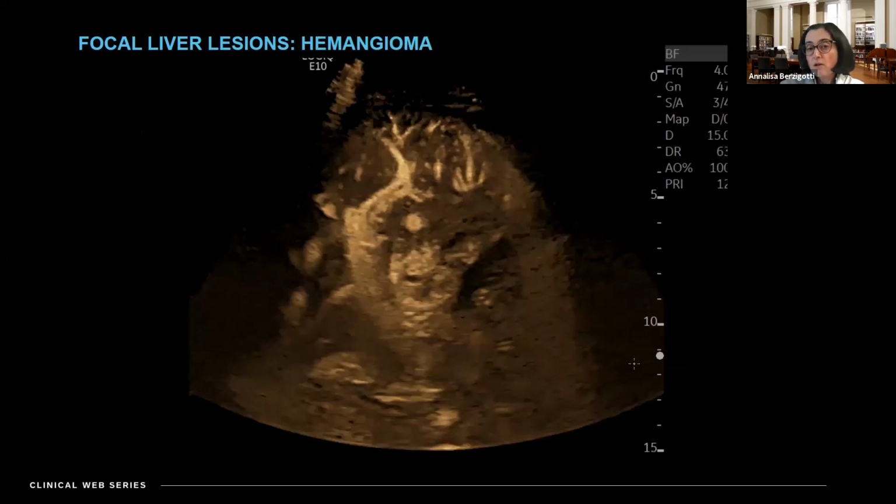So this is another patient who was, again, in a non-cirrhotic liver. He had this rounded lesion that looked totally benign, and as a first aspect, it was slightly hyperechogenic. But you see that looking with this technology, while on color Doppler, power Doppler and spectral Doppler, we could not get any signal at all, here there was flow. The flow was in the periphery of the lesion, and you can see a central part that has no vascularization, which is probably the central scar of the hemangioma.